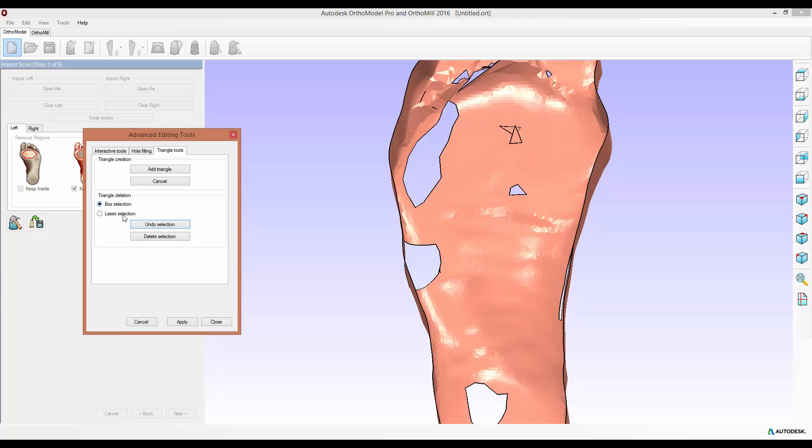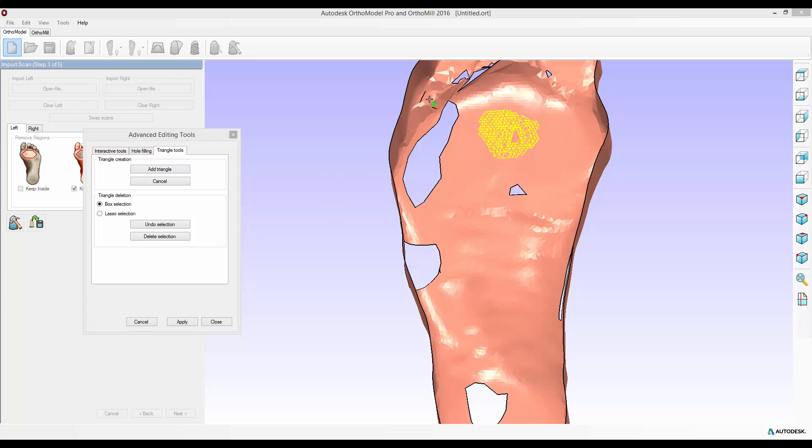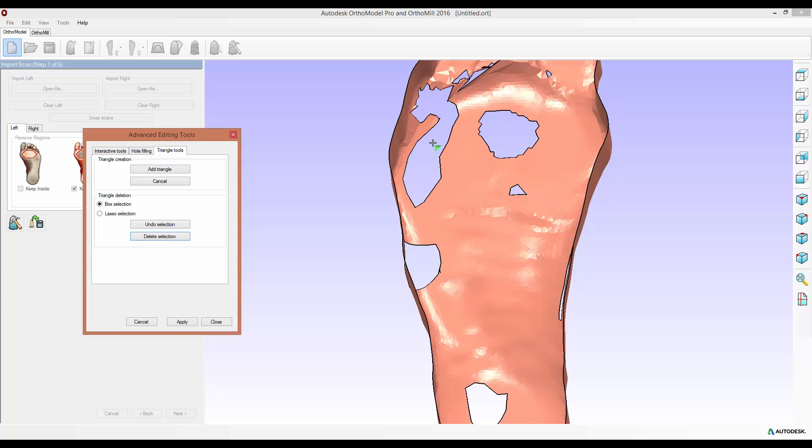The lasso selection works in a similar way as elsewhere within the software. Whenever you have a lasso symbol on your cursor you can click multiple times to sketch a bespoke area, close the curve and it will select all triangles within that area. You can combine the two, you can use a box selection and a lasso selection to select multiple regions at the same time and I'll just delete all of these for now.